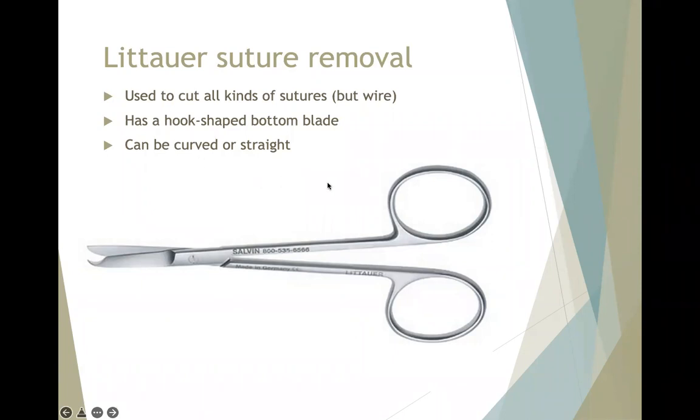Now, they do make them curved or straight. Personally, I've only ever used straight. I don't like curved. That would be like a curve here. I do like curved hemostats. And again, that's just my preference. There are other people that will like the curved. And you will also have your preference as well.